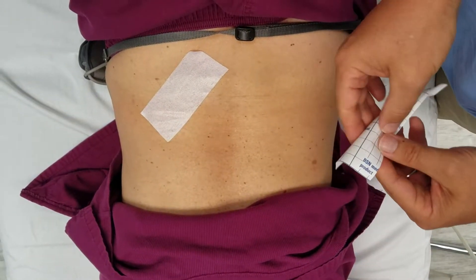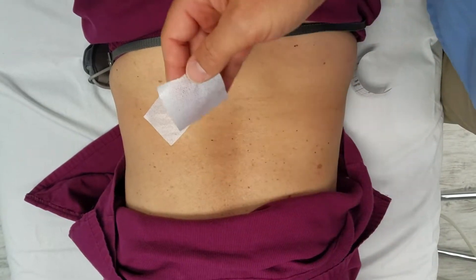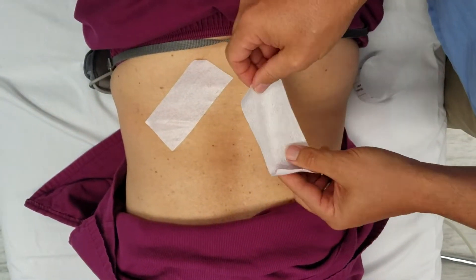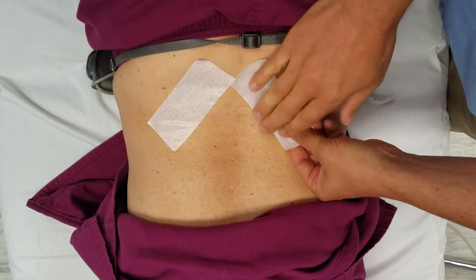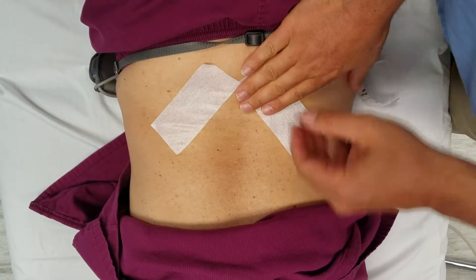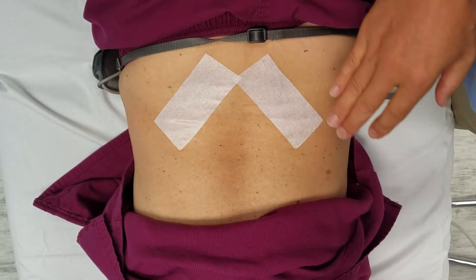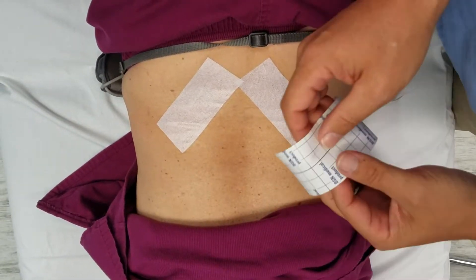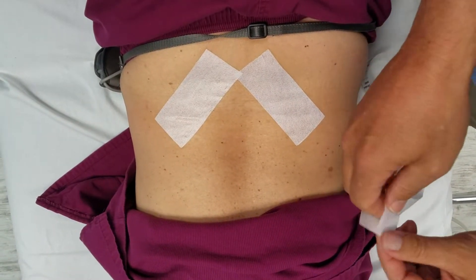Then we're going to do the other side. This is using two and a half squares of BSN Medical cover roll stretch. There's cover roll and cover roll stretch — both are good. I prefer the stretch a little better because it's more maneuverable to place on complex tissues.